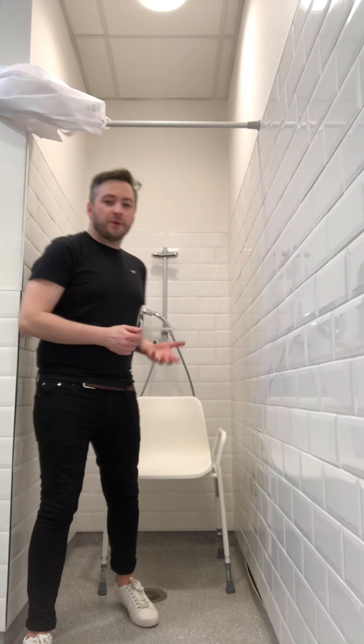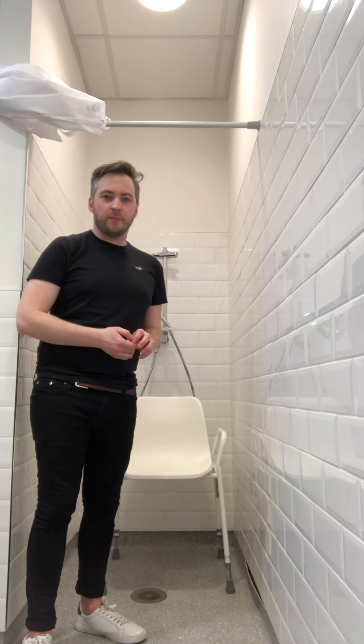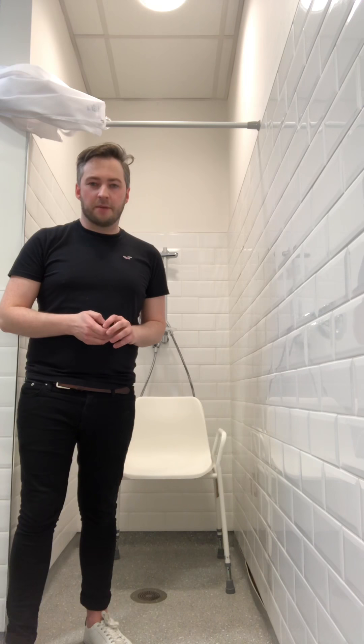Today I'm going to talk you through how to set up a shower chair, a mobile shower chair, and a shower stool in your bathroom at home. The type of people who would use this equipment are someone who might be having difficulty standing in their shower, someone who might need a carer to help them with their shower, or someone who's having difficulty with their balance. I'm going to talk through each piece of equipment separately and talk about some of the differences and similarities between them.